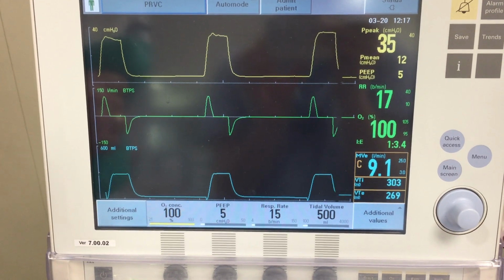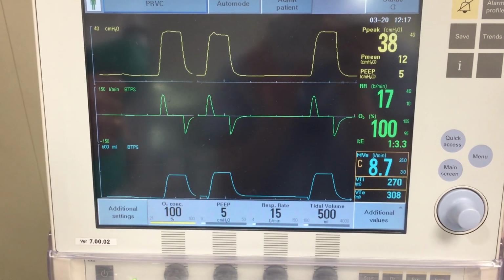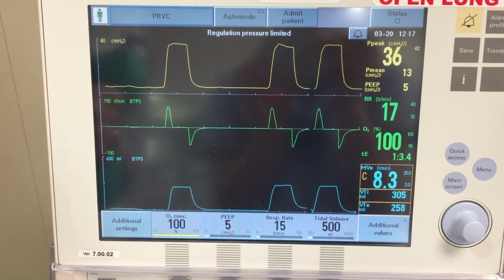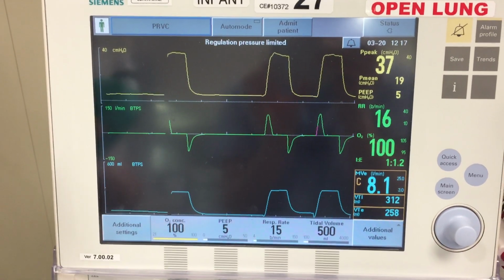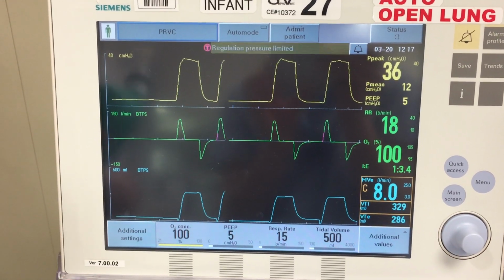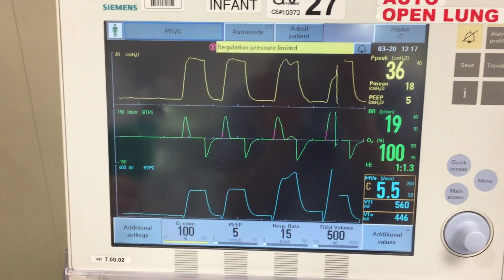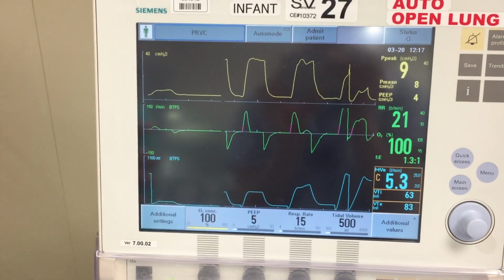And it's going to go up to that alarm of 40 that we talked about, and once it hits that level and it realizes it's still not getting that tidal volume, it'll let us know there's a problem, and we see the alarm comes up, regulation pressure limited. At that point, you have some stiff lungs or airway resistance, so it might be airway resistance requiring bronchodilators, or it may be just an ARDS kind of picture that we would expect from COVID.